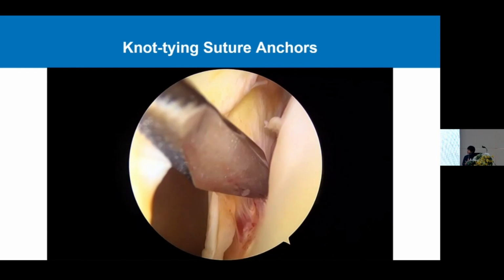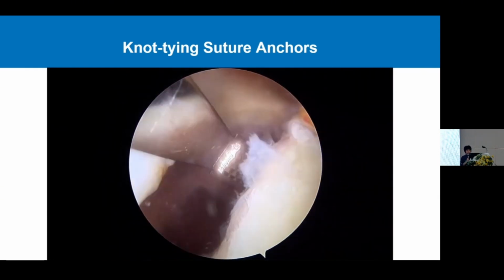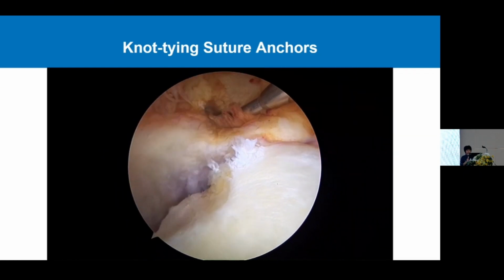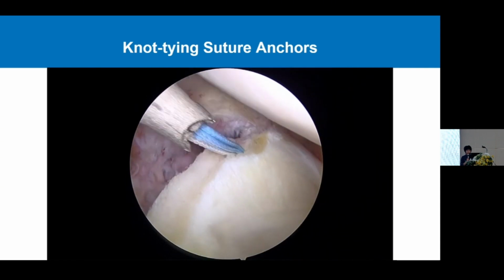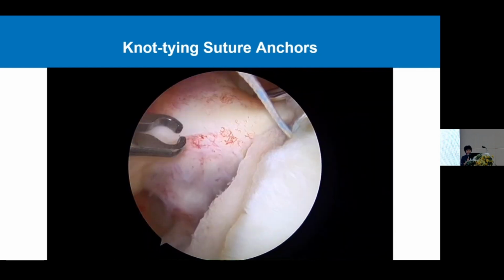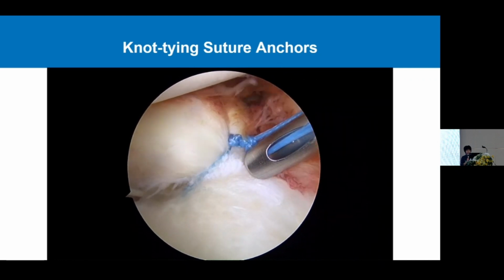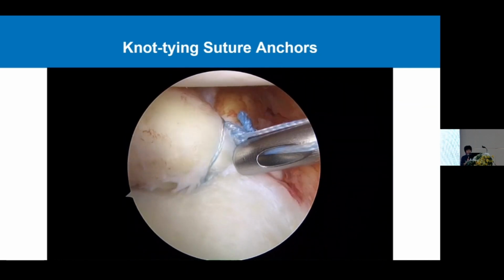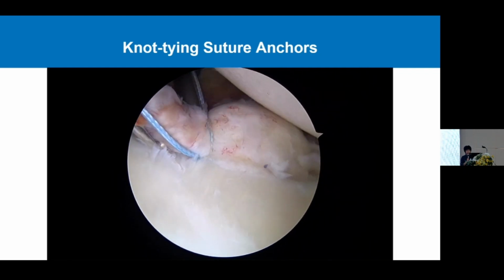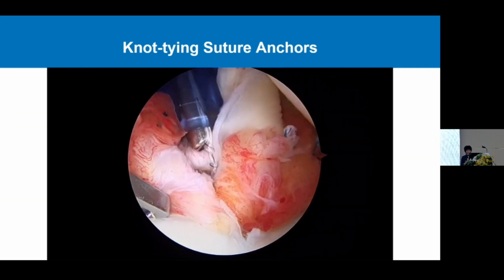After identifying the Bankart lesion, use the Bankart knife for labral mobilization. Then perform the bone bed preparation before suture anchor placement. The first suture anchor was placed at the inferior glenoid level, using the lasso suture passing device. And apply the knot tying suture technique and cut the suture respectively. The second, third, and fourth suture anchors were placed from inferior to superior glenoid level, respectively, and check the stability after finishing the repair.